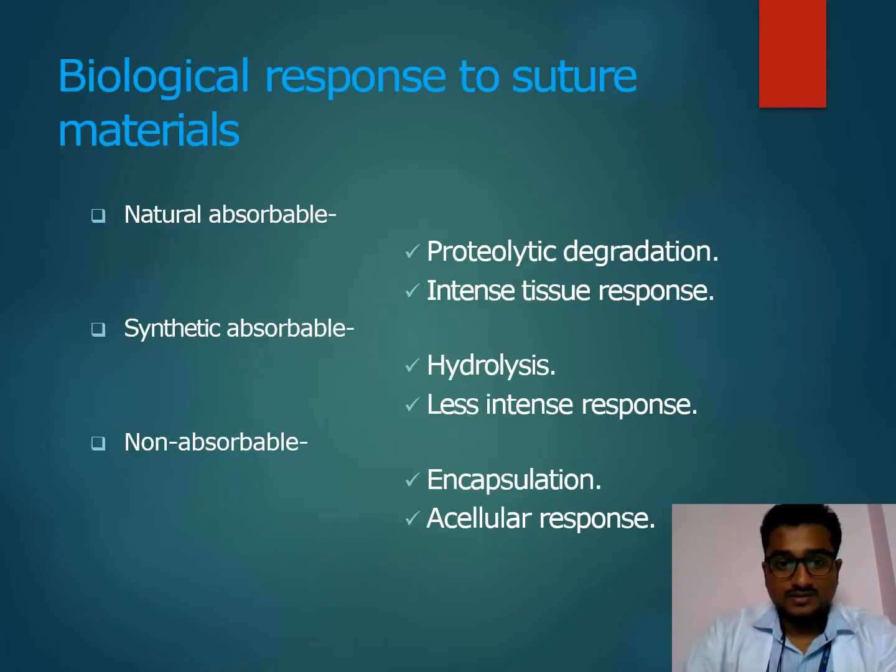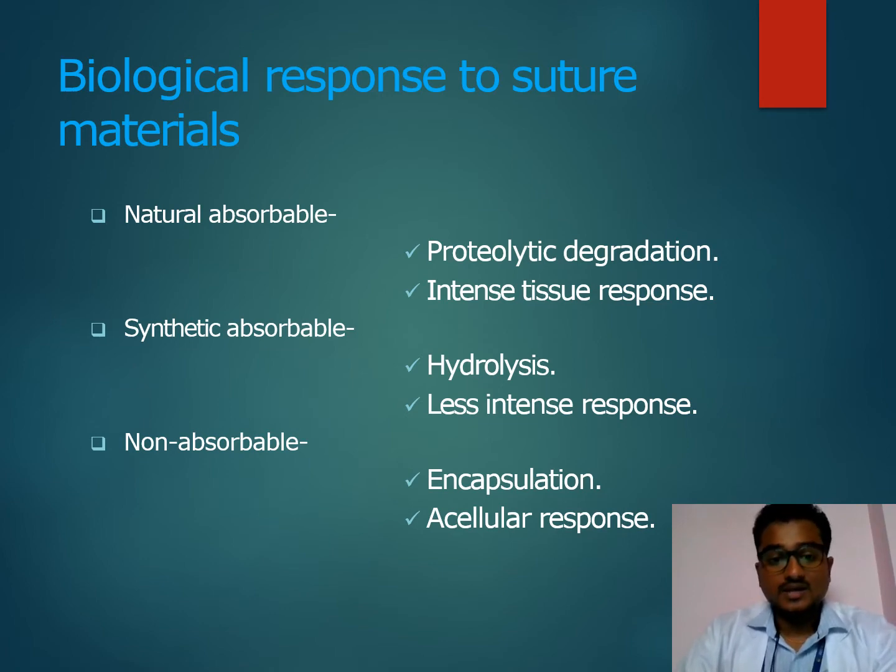Biological response to the suture material. Natural absorbable materials undergo proteolytic degeneration with an intense tissue response. Synthetic absorbable materials undergo hydrolysis with a less intense response. Non-absorbable suture materials are encapsulated, with an acellular response.